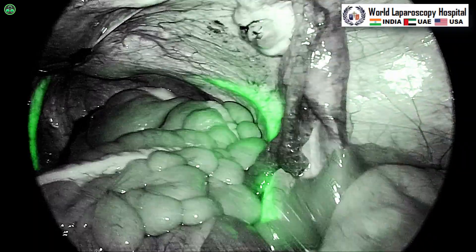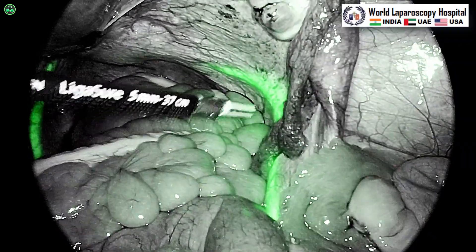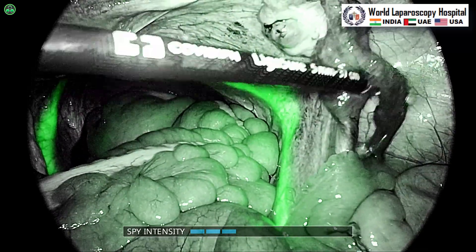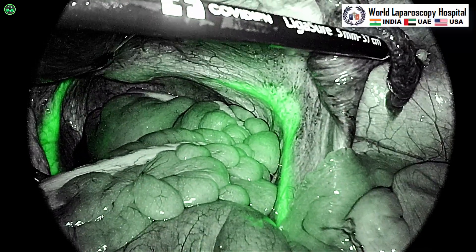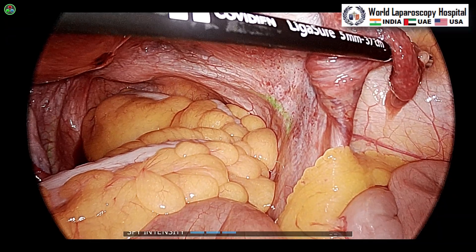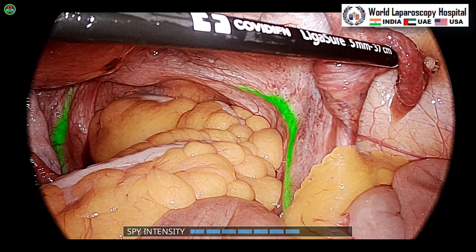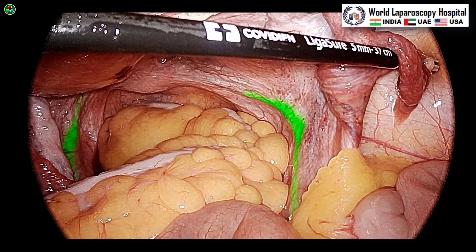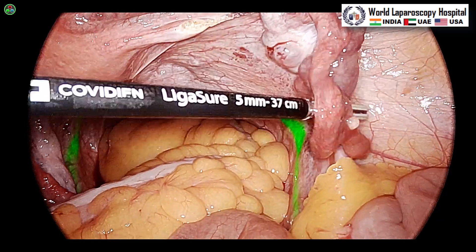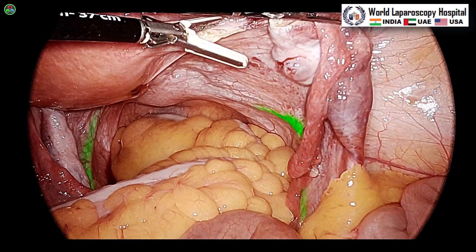The 1788 camera has a lot of advancement in fluorescent angiography, useful in cases of cholecystectomy and hysterectomy. This is the overlay mode — in overlay mode, the green color is shown together with the normal image and you can increase the contrast of the green color, which we have applied to the ureter via ICG.